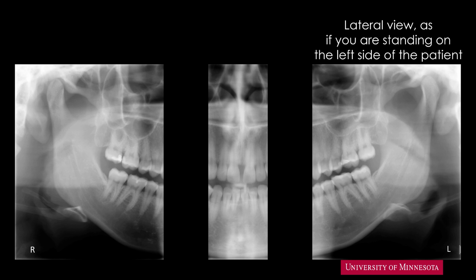Finally, we'll again consider the left posterior part of the jaws as a lateral view, as if this time we are standing on the left side of the patient. Remember that this is a rather simple explanation of the position of the anatomic landmarks for a very complex imaging technique. On this section, the cervical vertebra is on the right edge of the screen. By now, you may have realized that the cervical vertebra is recorded three times — once on the left edge, once on the center, and once on the right edge of the image.